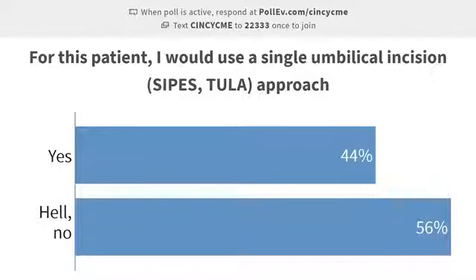Now, a lot of it depends on the body habitus, wouldn't you say? No, it depends on the surgeon. Surgeons are very committed to one or the other. I would disagree with that, but that's okay. We've disagreed before. I want to hit on what Whit just said. I will adjust what I do based on several factors. Some say always do the same thing no matter what. If they're large body habitus, I will do a 3-port appendectomy. I won't even try single port.